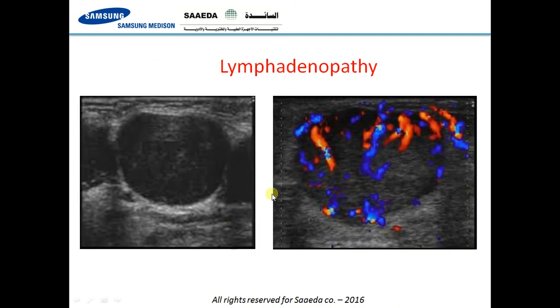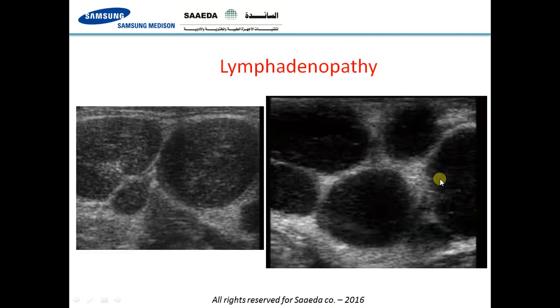This is an example of a malignant lymph node with no fatty hilum and markedly heterogeneous peripheral vascularity — an appearance typically seen in lymphoma.